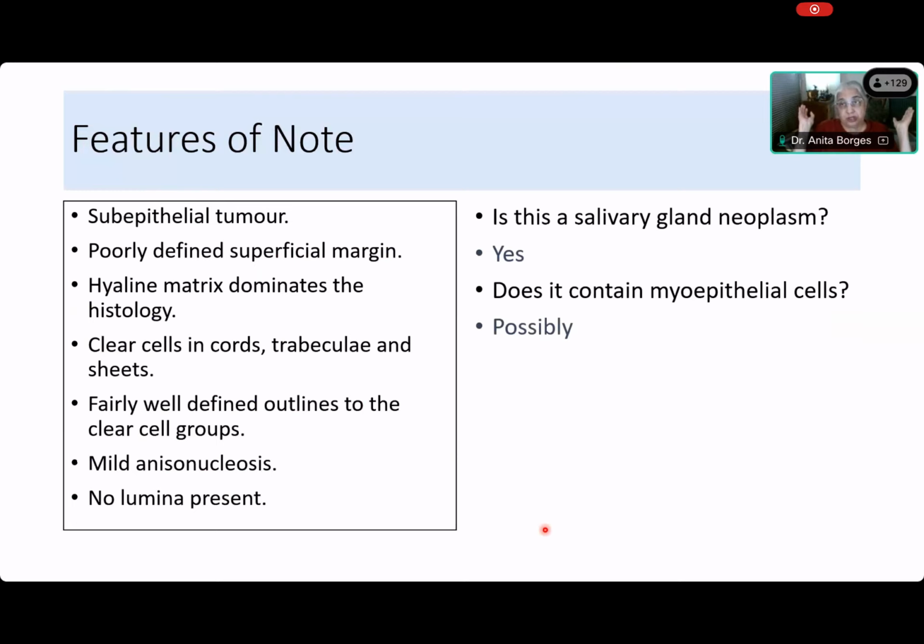They produce hyaline matrix, which is basement membrane-like matrix, because the normal function of myoepithelial cells is to produce a basement membrane. So basement membrane matrix, myxoid, chondroid, osteoid, myxochondroid. So they can produce any matrix. So why are you saying no? So the answer is, I don't know. Possibly these are myoepithelial cells. So now this is one place where we need to think differently.